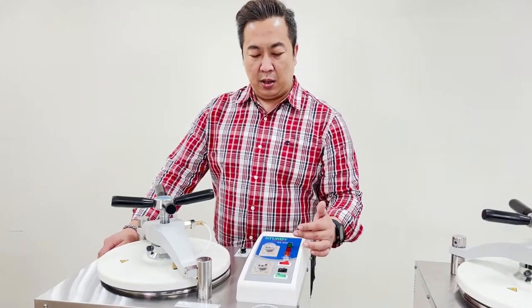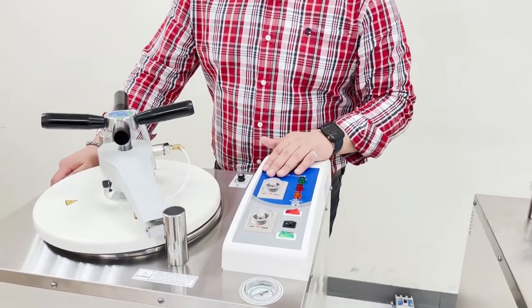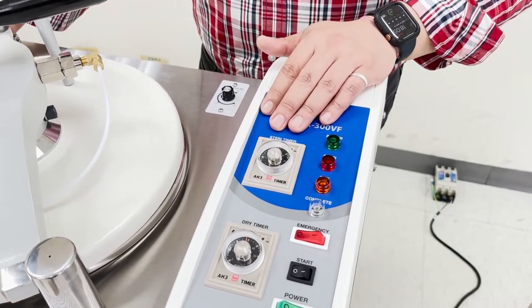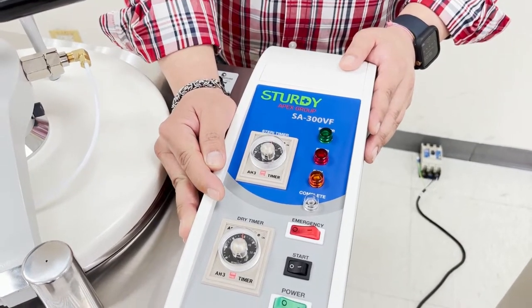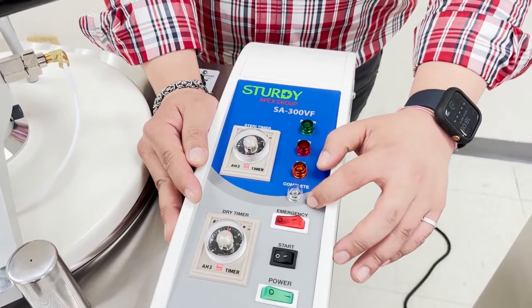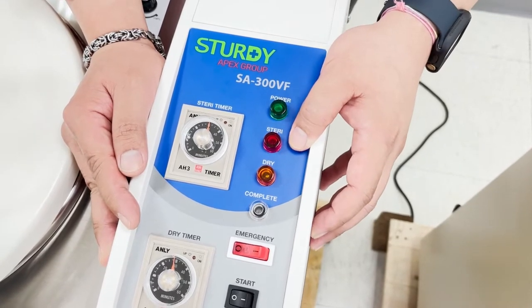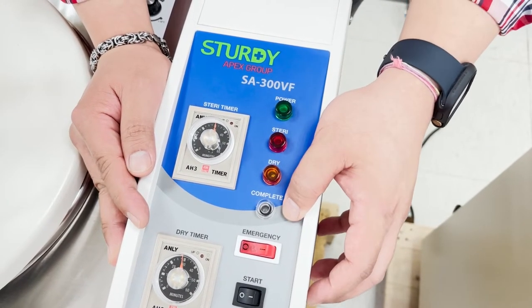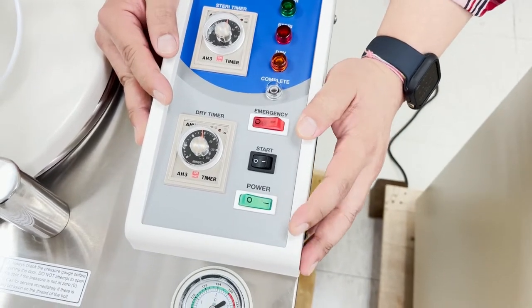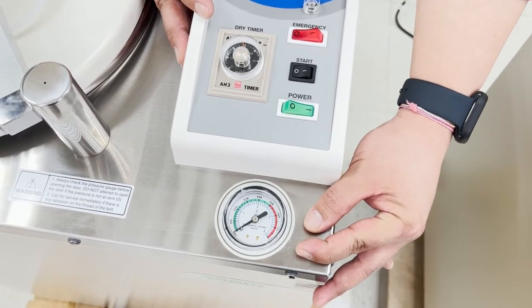On the control panel, we have two analog dials, indication lights, and various switches. The first mechanical analog is the sterilization time, which can be set from 0 to 60 minutes. The next is the dry timer analog, also set from 0 to 60 minutes. Indication lights show the process stages: power on, sterilization begins, dry, and complete. We also have the emergency button, the start button, the main power switch, and a mechanical analog indicating the temperature and pressure of the autoclave.